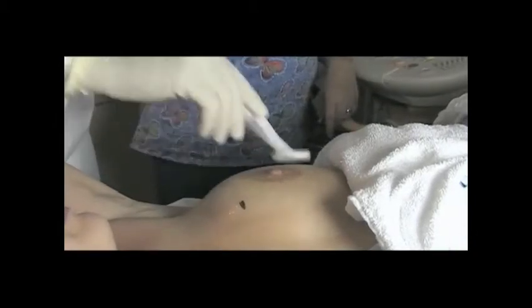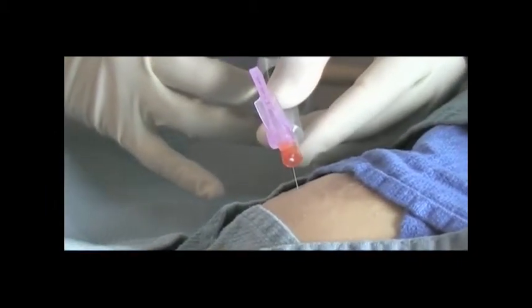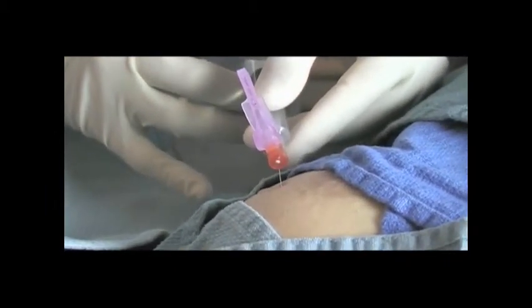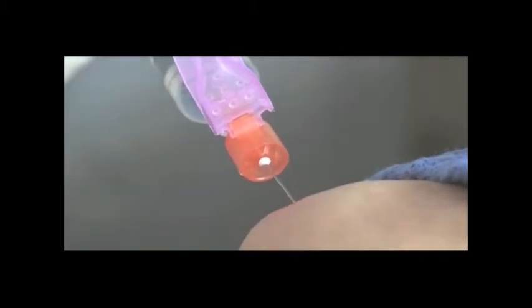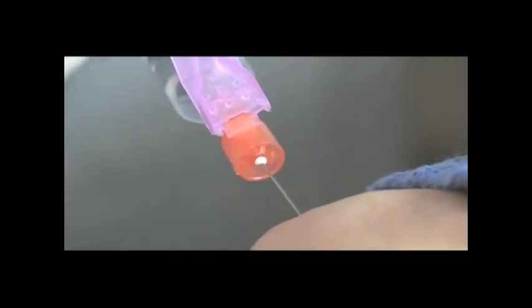Using a sterile cleanser, prepare the surface of the breast around the biopsy point of entry. Inject an anesthetic into the skin surface at the area of interest and then deep into the target site. During the procedure, the tip of the biopsy needle extends beyond the target site, so it is essential to administer anesthetic beyond this point.